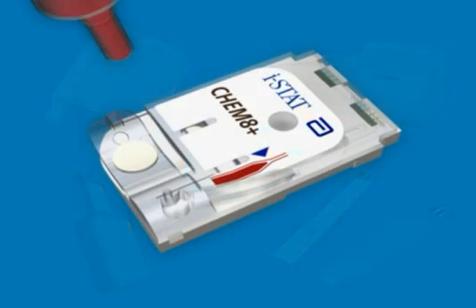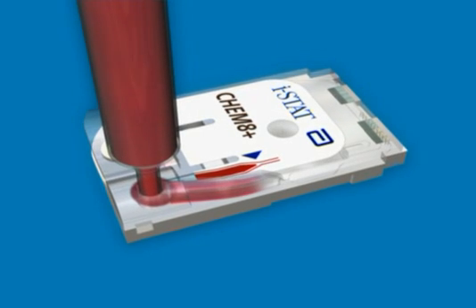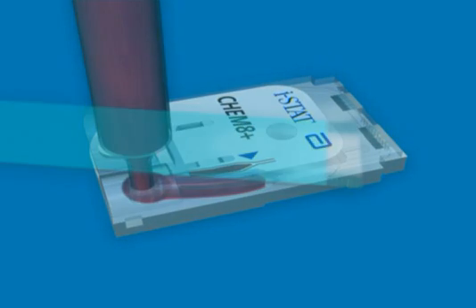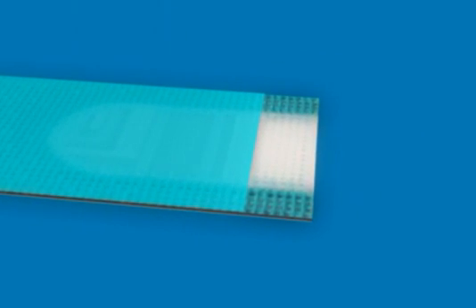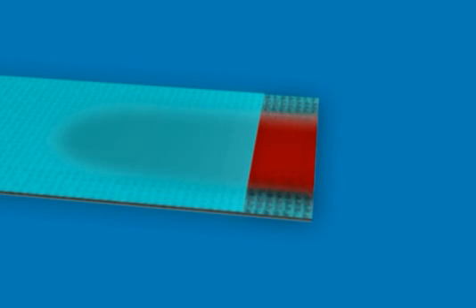The cartridges are intended for diagnostic in vitro quantification of various analytes in fresh whole blood. The glucose test strip is intended as a screening mechanism for in vitro quantification of glucose in fresh whole blood.